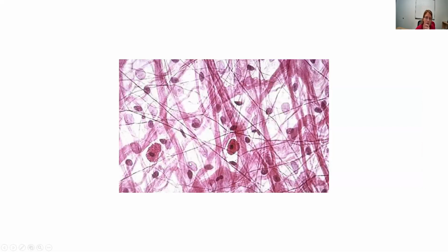All right, this one, I just look at this and I go, what the heck? Is this some sort of like Jackson Pollock painting or some sort of weird art? Let's see if I can figure it out. I don't see an edge anywhere. I see a whole bunch of holes. But you know what? I see these long ribbon-like threads. Those are collagen. Like I said, you don't have to know that's collagen, but to me it helps to see this ribbon-like thread, and I start to see collagen, and I see these darker lines that look like somebody just took a marker and just started drawing on them. Those are also going to be fibers. So I've got these thicker ribbon-like fibers, and I've got these thinner fibers.